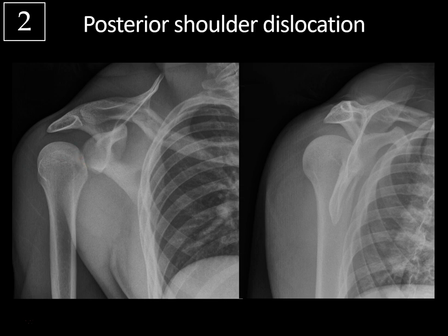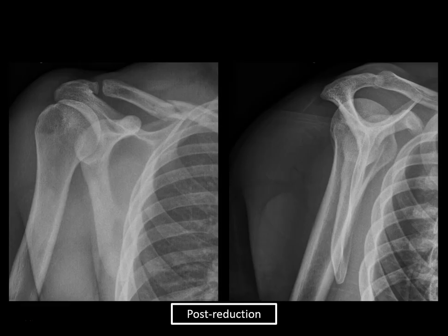If the humeral head is impacted against the glenoid, you might get a trough line sign — a dense vertical line in the medial humeral head due to impaction — but we don't have that in this case. You might also have the rim sign where the glenohumeral joint is widened to greater than 6 millimeters, and possible disruption of the scapulohumeral arch. On the post-reduction images, you can see a normal half-moon overlap sign with the glenoid and humeral head overlapping nicely, no glenohumeral widening, and no lightbulb appearance — a normally reduced right shoulder.